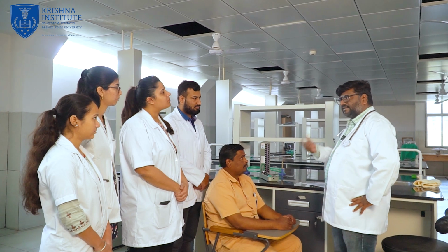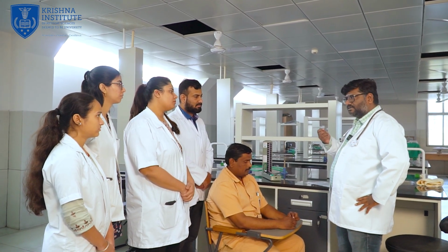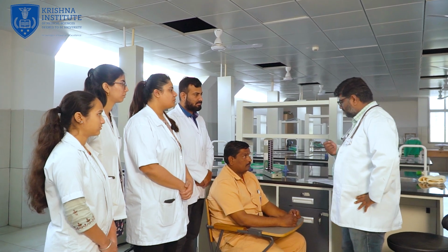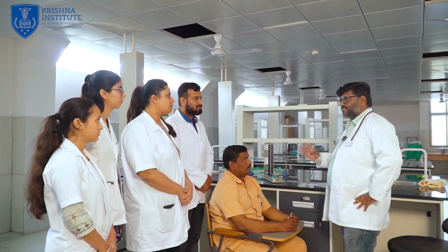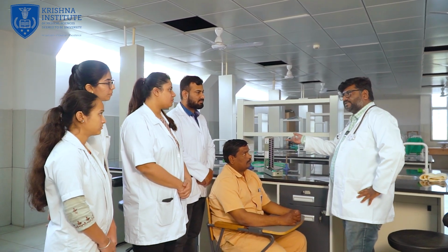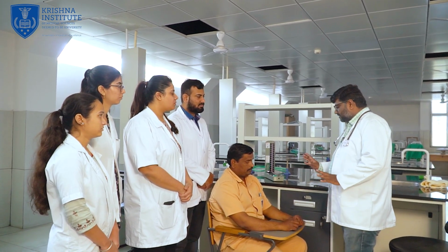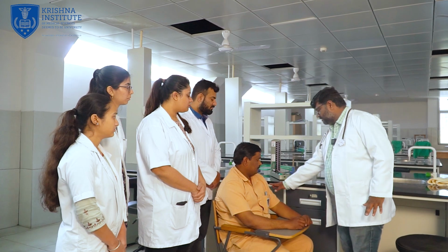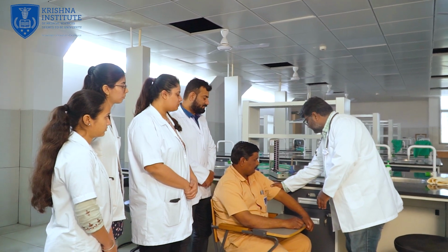Take the consent of the patient and briefly explain what you are going to measure. Then position the patient. He should be sitting comfortably in the chair. Either you can take in a supine position or in a sitting position. If you are taking in sitting position, properly position the patient, and the arm should be at the level of the heart. So you can keep it like this.